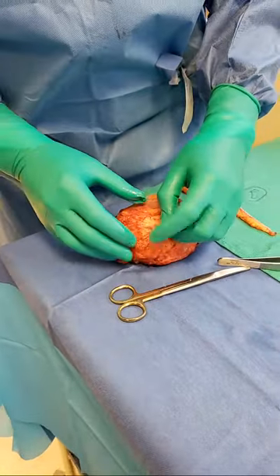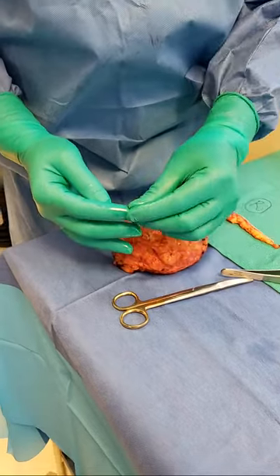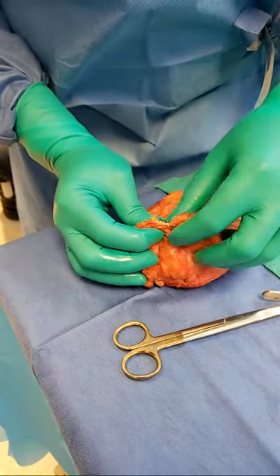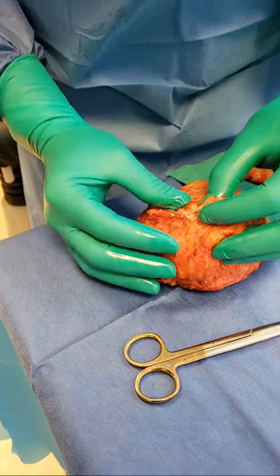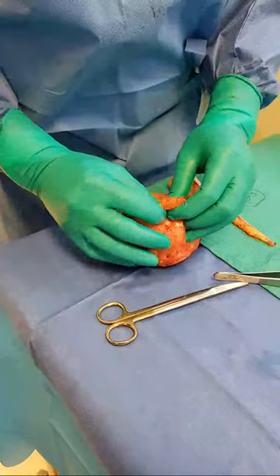Someone asked me yesterday, why do you remove excess tissue? If I go like this — see this discharge right here? This looks like green. I'm going to go ahead and press over here. It's like you're popping a pimple. So this is all bad tissue. This has to go. I cannot stress enough — you cannot look at this and say it's okay.